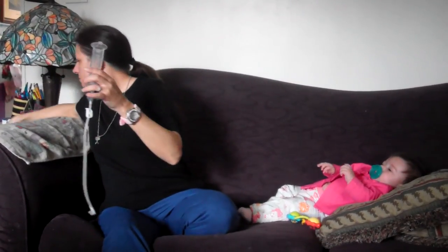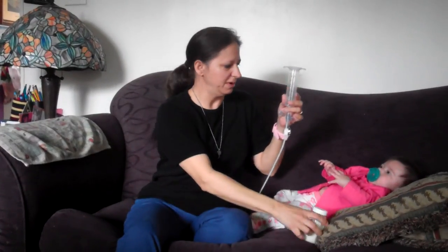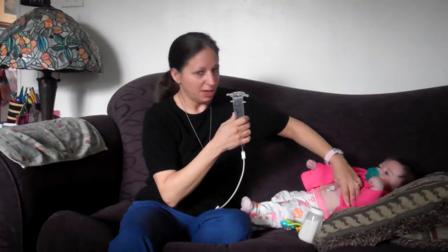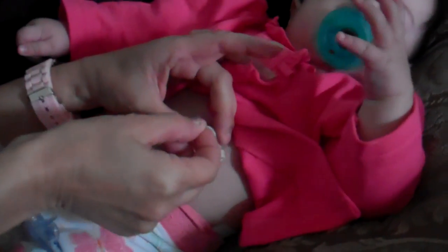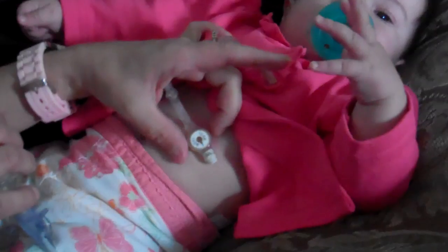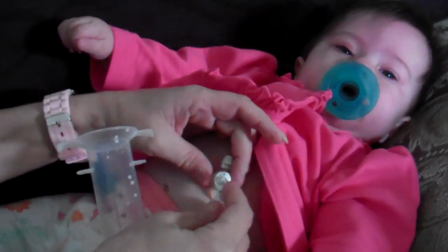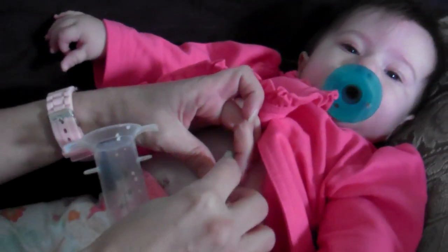So now, Hannah's hungry and she's ready to eat. And so, you want me to go close up over there? I put this, yeah. This is her Mickey button, and all you do is you open it up, right there, really easy. You can twist it around, if that's good. And then you have this, you see a little black line, and all you do is line it up with the black line on here. And push it in.